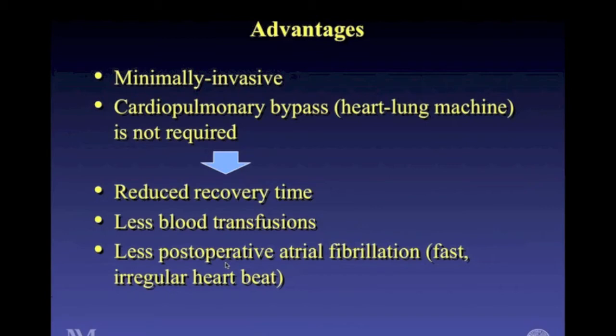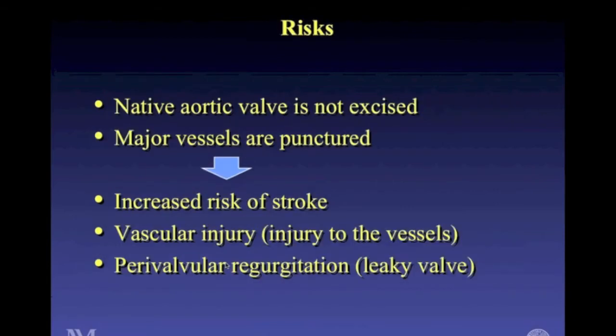Now that leads to some very important advantages for the patient. Reduced recovery time is a big plus for Tabby or TAVR. There's less need for blood transfusions, and there's less incidence of postoperative atrial fibrillation, and that is a fast, irregular heartbeat that happens commonly after heart operations.